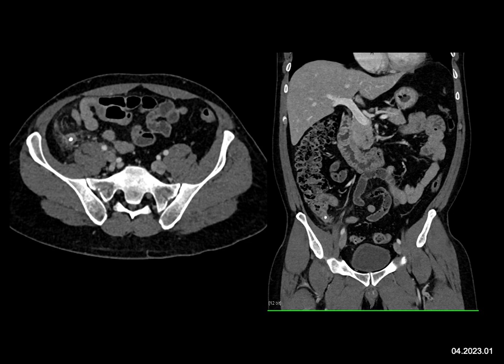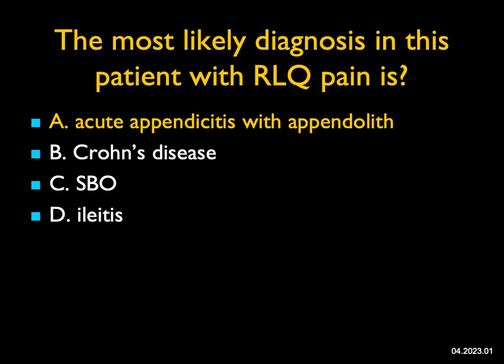This is a classic case of acute appendicitis with an appendolith. Does this patient need surgery? Likely yes, though more and more patients are being treated with antibiotics depending on how minor the inflammation is. This is a good example of the importance of IV contrast in enhancing the appendix — a really classic case.